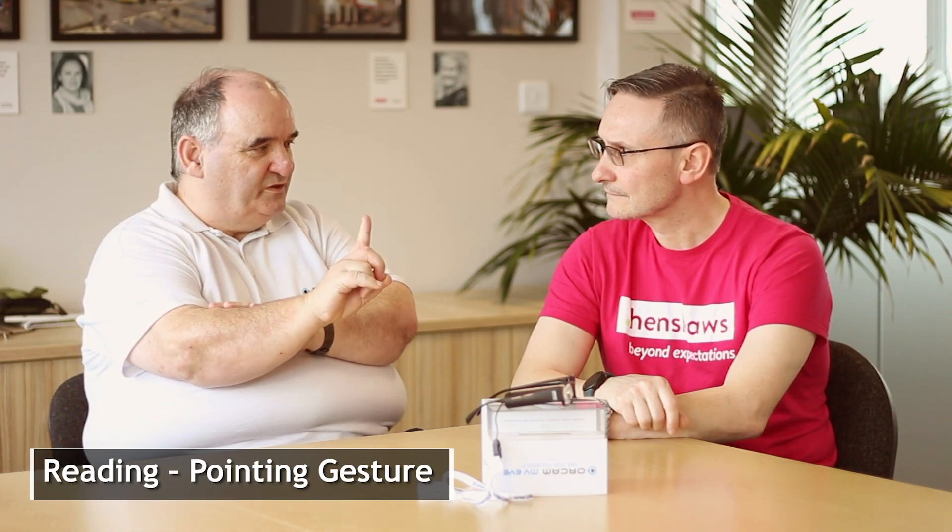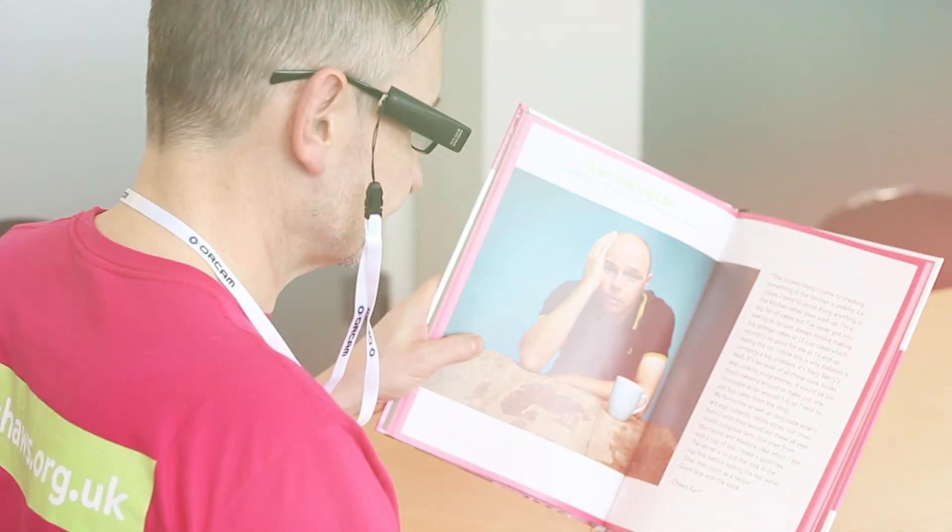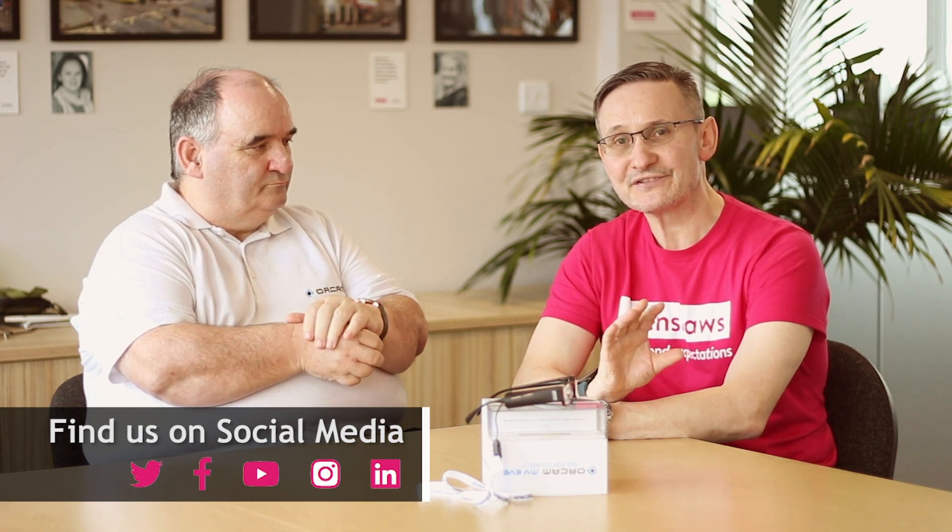There are various activation methods. Our focused one is the pointing gesture — take your index finger pointing it to the ceiling with the nail bed facing your nose. When you point into an area of text you hear a little click, drop your finger out of the camera's view, and the camera will instantaneously read that text. That click is basically taking a photograph of the text you present to it.